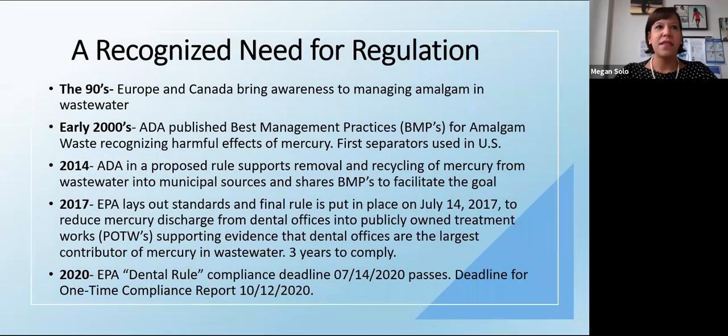Absolutely. Thank you, Jamie. The best place to start is how we got here, which is just a little bit of history. In the early 90s, Europe and Canada started to bring awareness to managing amalgam and mercury in wastewater, which led to the development of the first amalgam separators. However, they weren't compatible with practices here in the United States. So not long after, in the early 2000s, the first amalgam separators were introduced here in the United States in dental practices. Since 2003, the ADA has published best management practices for amalgam waste. This version and the current version provide information to outline the management and recycling of dental amalgam waste in order to protect the environment.